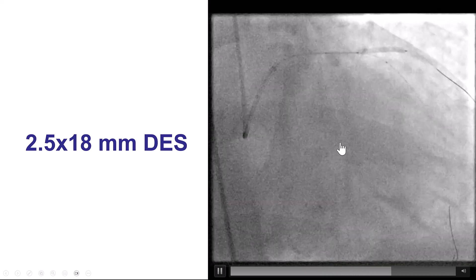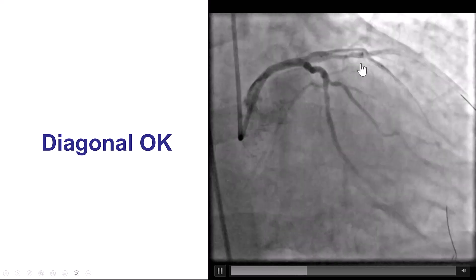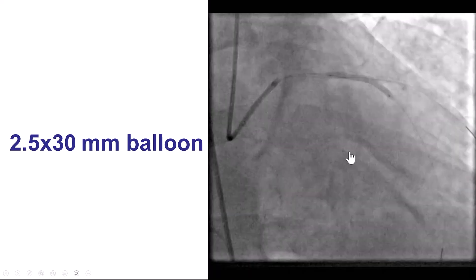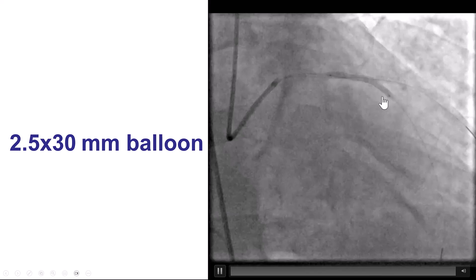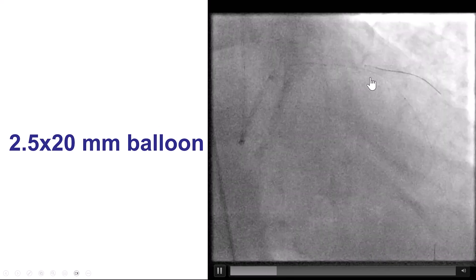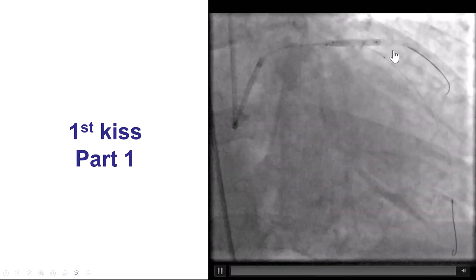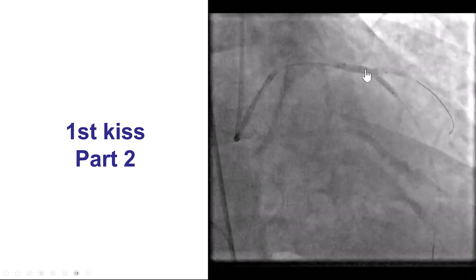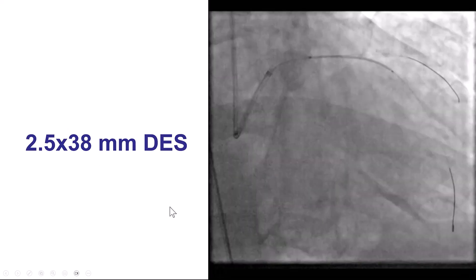The stent was deployed, and then we confirmed that we had good distal flow before crushing it with a 2.5-by-30-millimeter balloon that had been placed before. We were then able to rewire. We advanced a small balloon into the circumflex and did the sequential kissing — first into the diagonal branch, then into the LAD, and then together. So that was the first kiss.